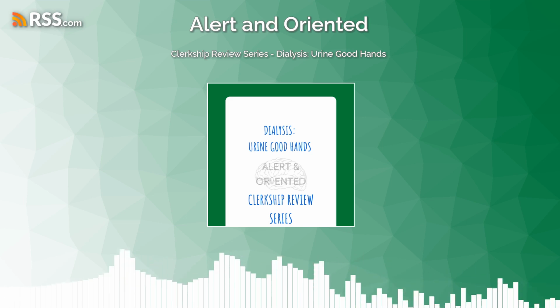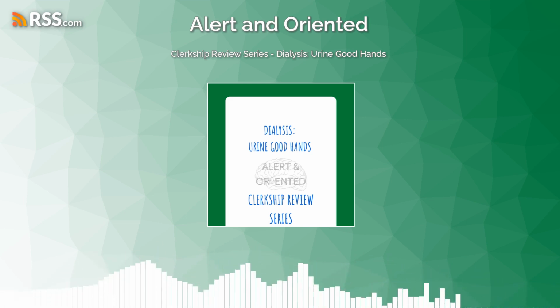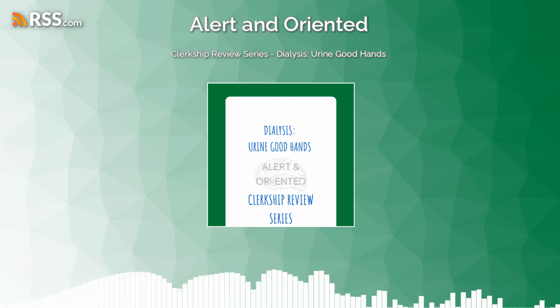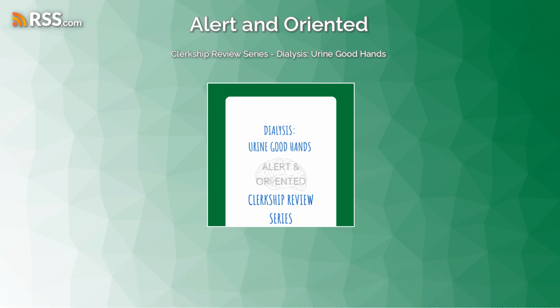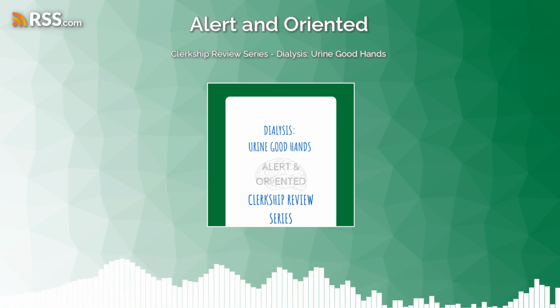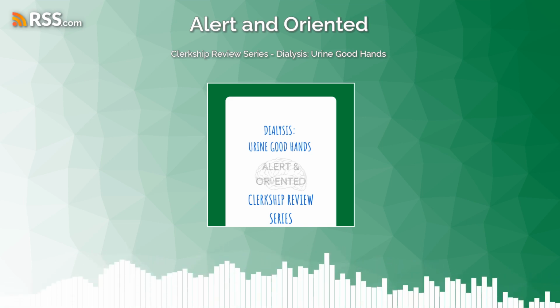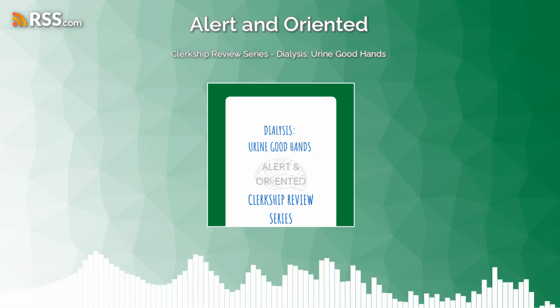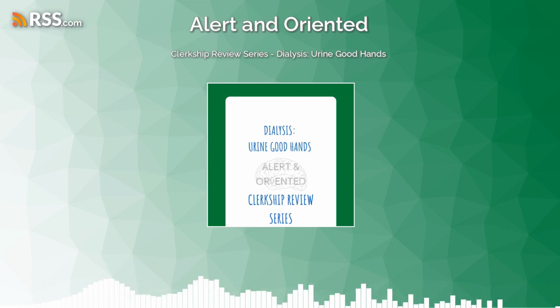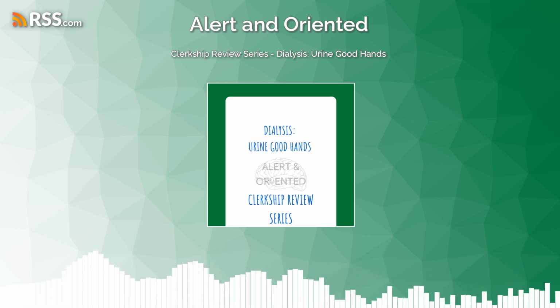Most dialysis treatments that we do utilize both a cleaning process and a fluid removal process. So most dialysis treatments have a UF goal as well as clearance goals. And if a patient has a lot of fluid, we may take 3, 4, 5 liters of fluid over a dialysis course, whether it's a 3-hour treatment or a 24-hour treatment. And if the patient doesn't have extra fluid, they may actually be hypotensive.